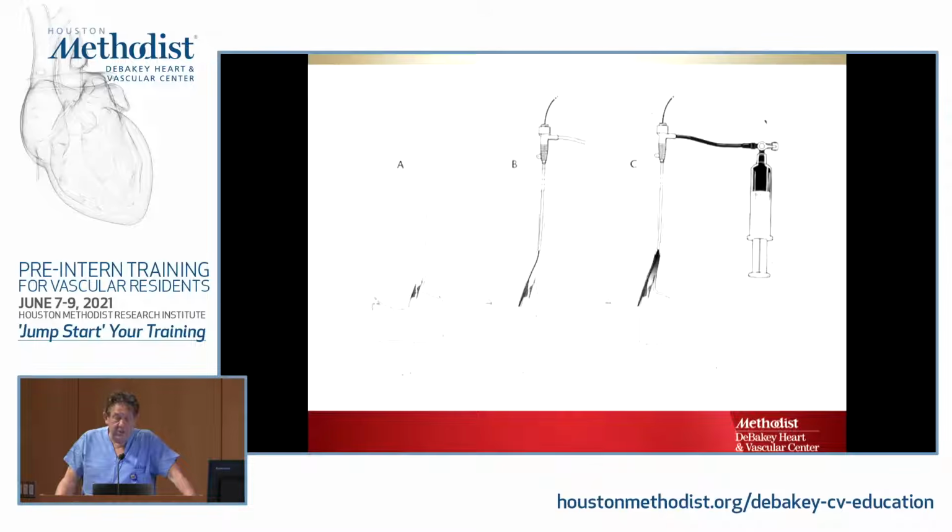One of the differences with a diagnostic catheter, when it's got a wire in there, is that you can't inject dye through it. So imagine you're in a situation where you have a diagnostic catheter above a stenosis, and you manage to get a wire through it, and you want to check that the wire isn't through that stenosis. You can't do it because the wire jams the inside of the catheter. And so that's where sheaths really come as a real advantage, actually.